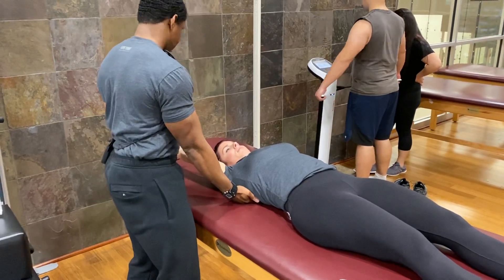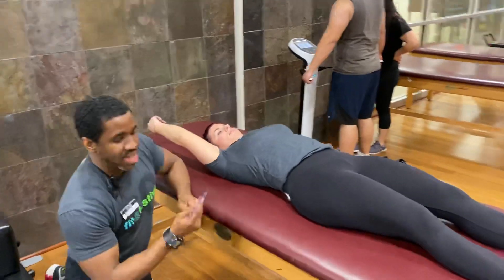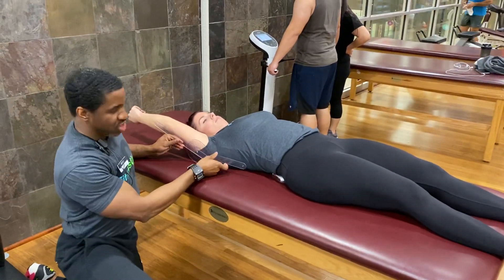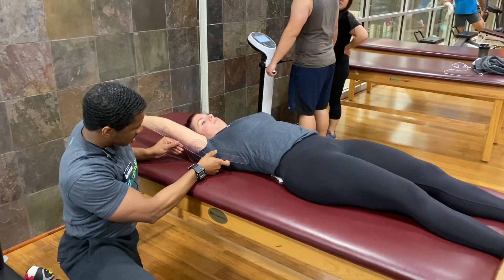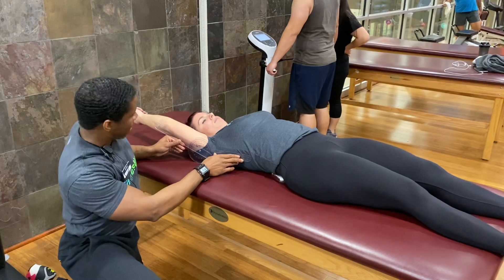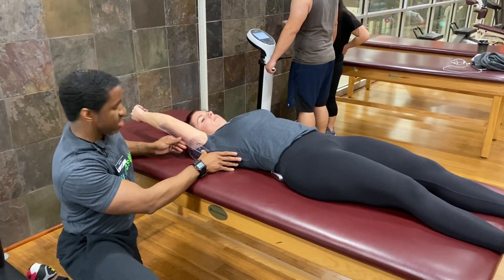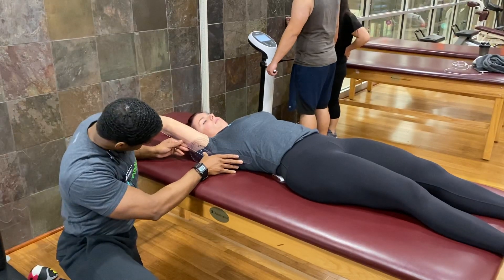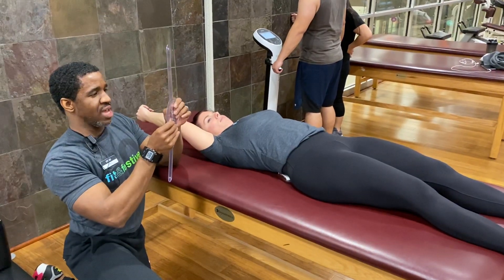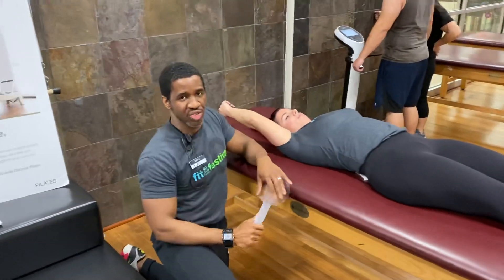Right about there is where I feel that, so maintain this position. I'm going to align the axis of my goniometer with her lateral shoulder, one inch distal to the acromion. The stabilization arm with the mid-axillary line of her upper body. Here I measure 163 degrees of shoulder flexion on the right side. Normal values are 160 degrees.